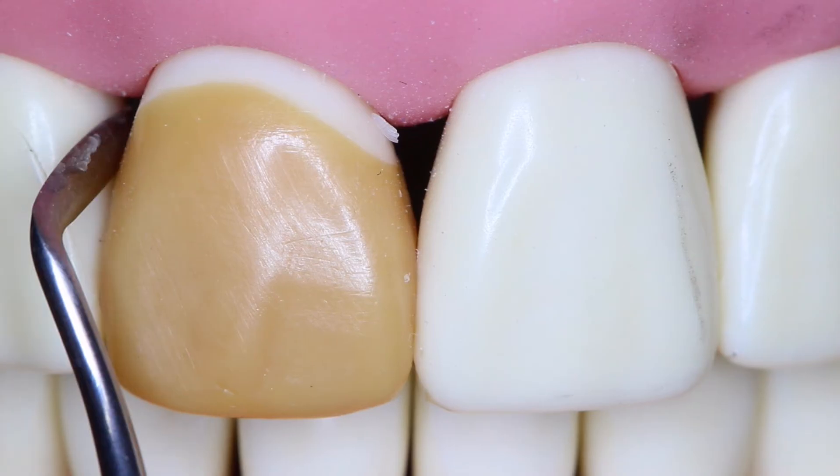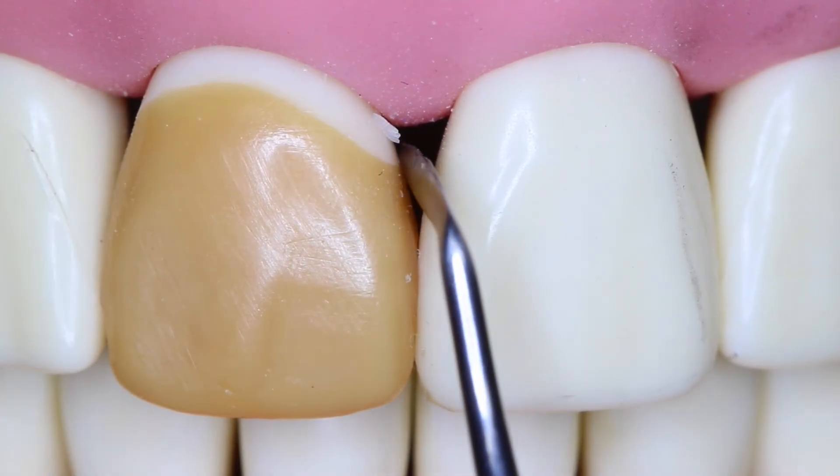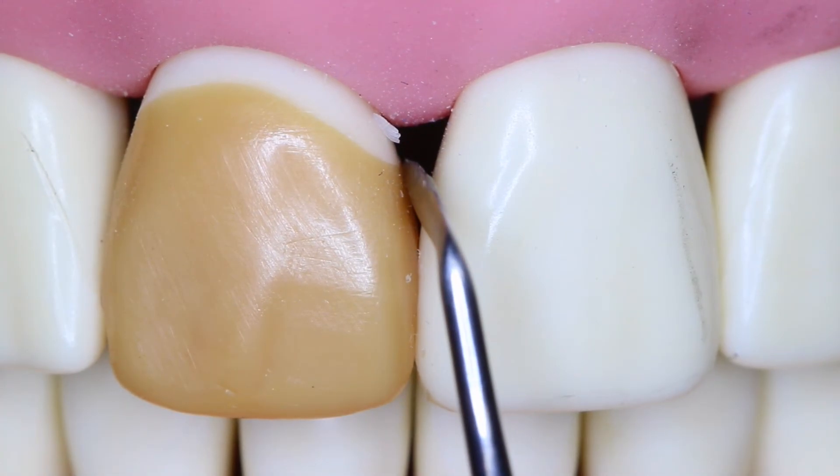Now looking at the distal cervical embrasure, we can see that without the interdental papilla it makes it very difficult to follow the emergence profile. The length of this preparation also makes it more difficult to follow the same emergence profile. Moving to the mesial cervical area, the height of contour of that profile looks very good. Notice that the interdental papilla would show you a lot more information.